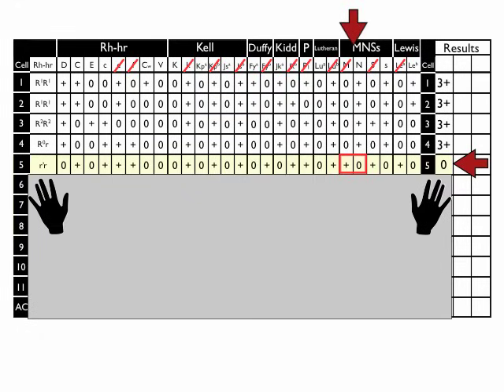I should make mention of one thing. I talked about how you don't want to do crossouts based on single doses of the antigens. That is really true across the board. It's especially true for blood groups that show dosage, such as Duffy and Kidd.